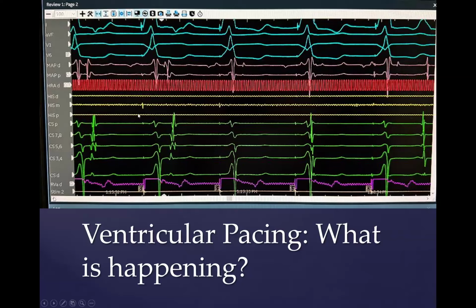So in actuality, we can see the pathway in real time; if we had noticed, it was already getting longer before it went away. So really, the pathway was somewhere between where the catheter was at this location and where it is at this location. And it can be interesting on CARTO to see that the catheter could be as much as 4 millimeters apart in these 2 locations. So that's why you really want to map it, not use CARTO to go back to the spot. It's nice to have the CARTO so that you can do something during the case if the pathway were not to come back, but really the preference is to wait until it comes back.